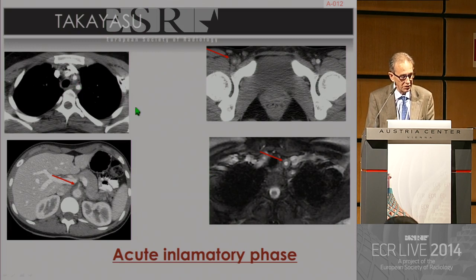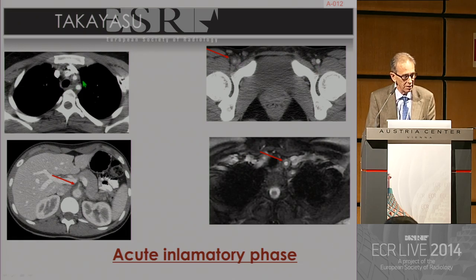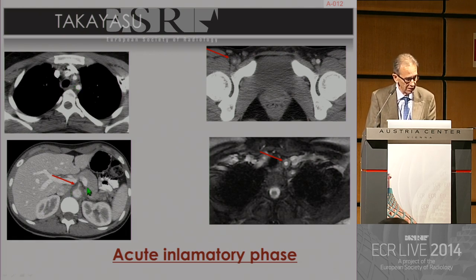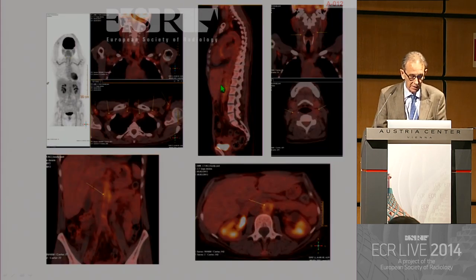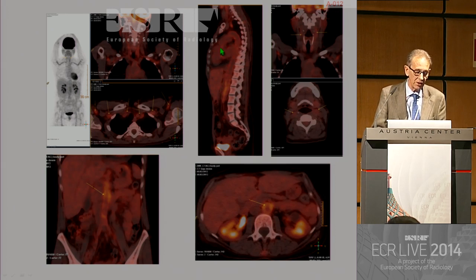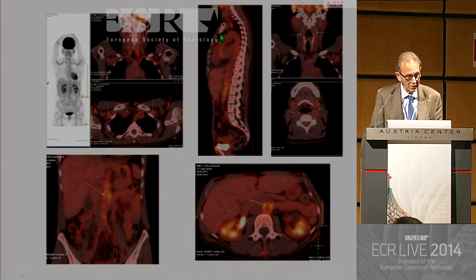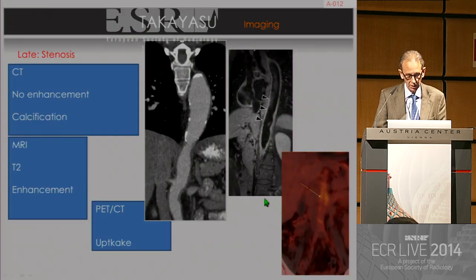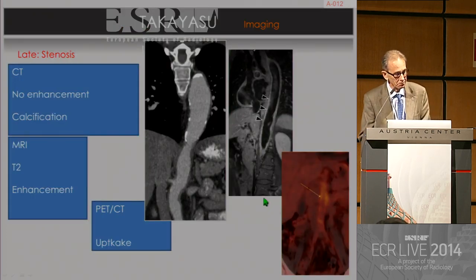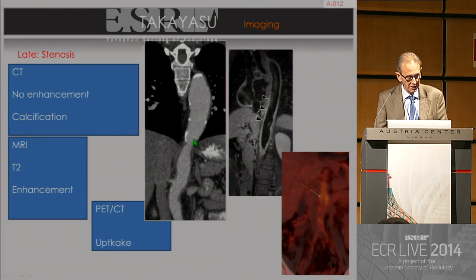This is a case of Takayasu, where we see thickening of the femoral artery on the right side compared to the left, and changes in the mediastinal fat due to the inflammatory process. You also see the aorta and celiac trunk involved. In MRI, you see the thickening of the wall very clearly. In PET-CT, we will see increased glucose uptake in the walls of different vessels, allowing us to find the extension of the disease. In late phases of Takayasu, you may have stenosis, aneurysm or dilatations, with calcifications of the walls.